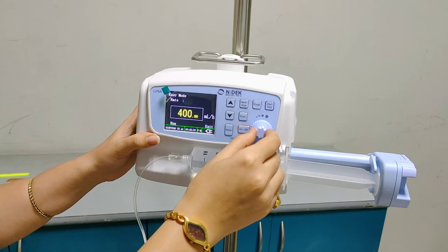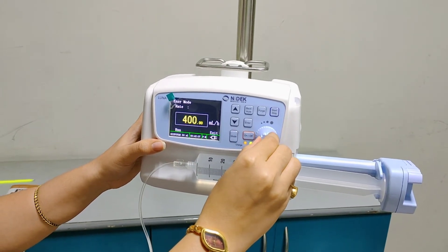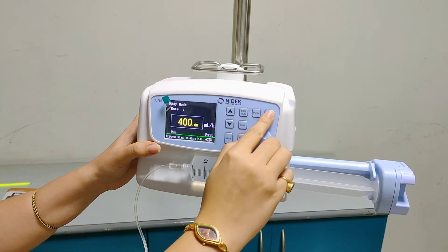This flow rate can also be set with the trim knob, like this. And then we need to start the machine.